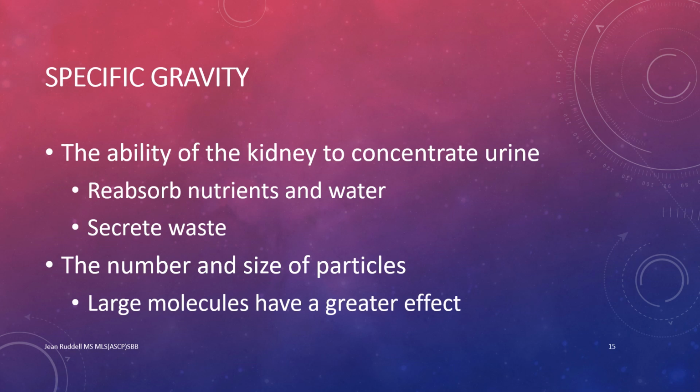Specific gravity. One of the most important functions of the kidney is to reabsorb nutrients, reabsorb water, and secrete waste. The specific gravity helps us to evaluate these functions of the kidney. The specific gravity is affected by the number of particles and also the particle size. Large particles have a greater effect than smaller particles.